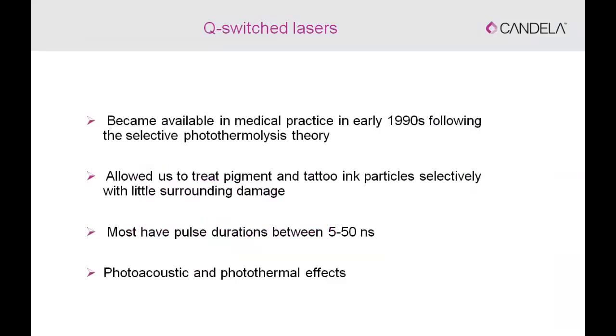So we'll start with an introduction before we delve into the PicoWay. We'll just give you a bit of background history of the Q-switch lasers. Q-switch lasers were around since the 90s, and they came after the photothermal theory and allowed us to treat pigmentation and tattooing particles selectively with little surrounding damage, given the fact that they had a very short pulse duration in the nanosecond domain.